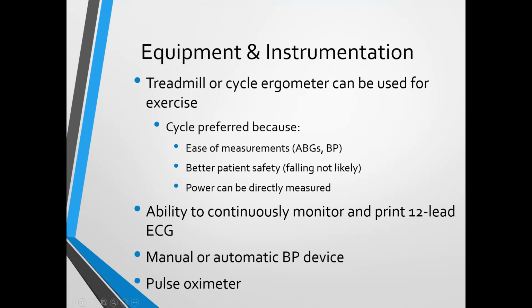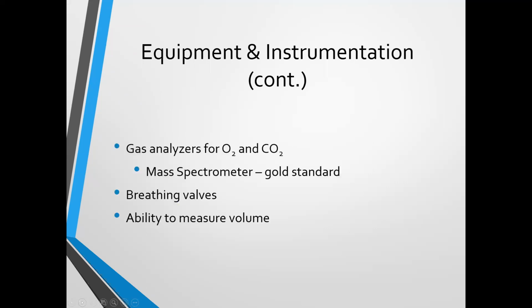In fact, last holiday season, as the lead therapist, we bought all of our therapists a pulse oximeter, a bottle of wine, a little gift basket, if you will. They probably preferred the wine over the pulse oximeter, but in any event, we got them some nice little goodies. It's a good thing to have for a whole lot of reasons, including when you're doing exercise stress testing.